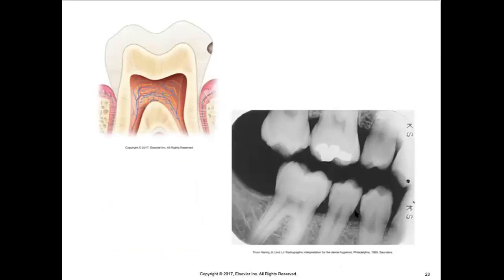And then we can see it very faintly here. This is tooth number 29. If we look very, very closely, you can see that little dark shadow right underneath the contact between tooth 29 and 30. And since it hasn't gone halfway through that enamel yet, it is still considered incipient.